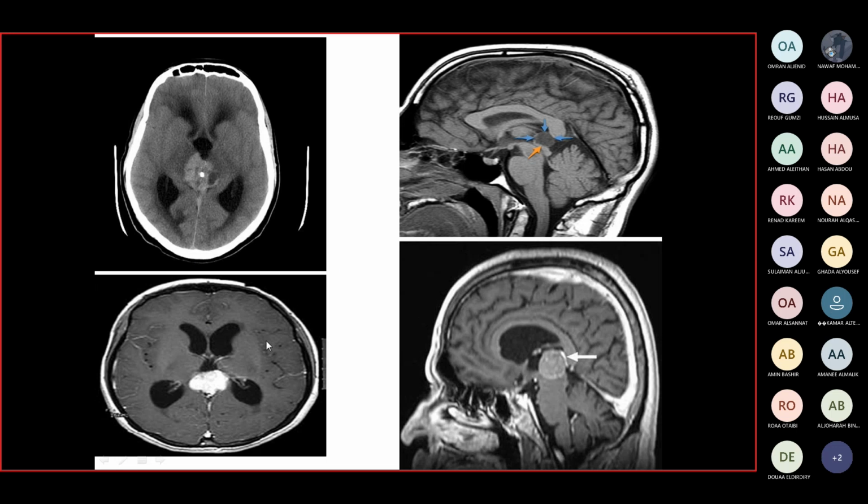What is this imaging modality? I think that's MRI. Or CT? MRI. Yes, this is MRI. This is the subcutaneous fat. The bone here is black, and the soft tissue resolution is better than in CT. Where is this abnormality or lesion? It's in the middle. It is a midline. Yes, and in front of it, the third ventricle.